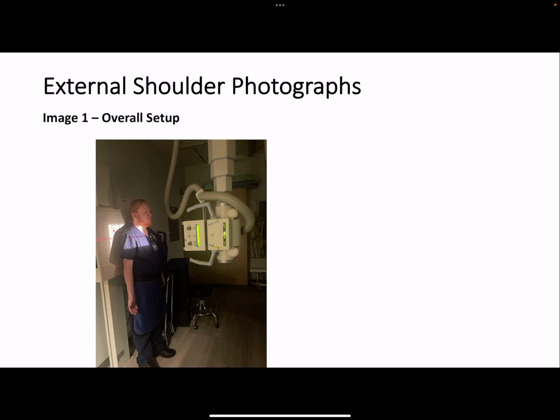For part positioning, the scapulohumeral joint is centered to the IR, with the arm slightly externally rotated until the epicondyles of the distal humerus are parallel to the IR. The hands are supinated. The greater tubercle is seen in full profile.